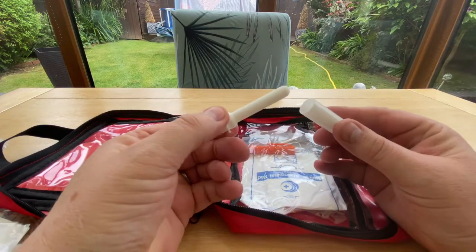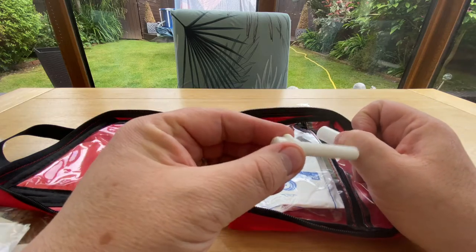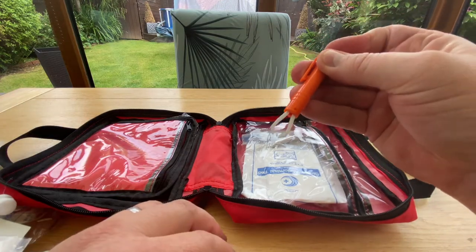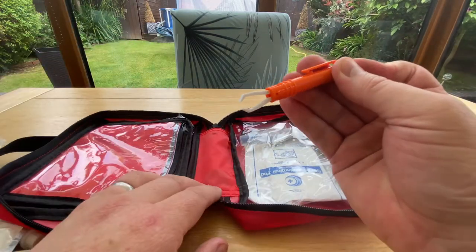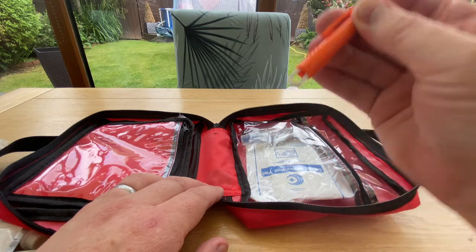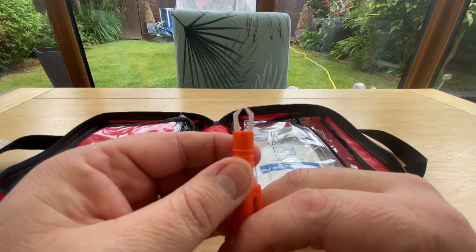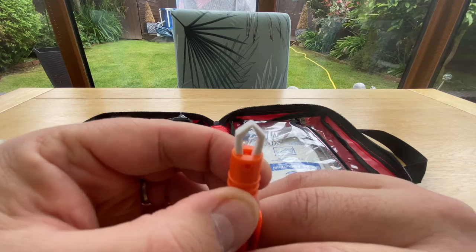I think this is a styptic pen — basically if you cut yourself you rub it on and it stops the bleeding and the sting. You find these in barber shops. There's also a tick remover: if your dog, cat or any pet has been in long grass or around sheep, they'll inevitably pick up ticks. You grab the tick with the remover, twist and pull, and the tick comes off. I'd definitely read the instructions on that one, because you do hear horror stories about breaking the tick's head off and it getting buried inside the skin.